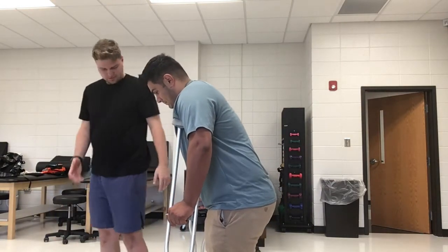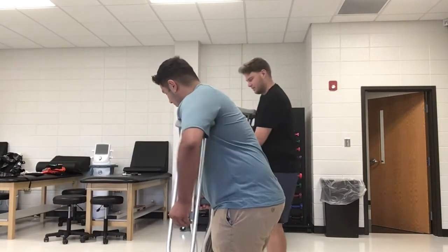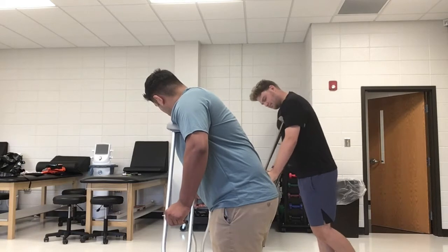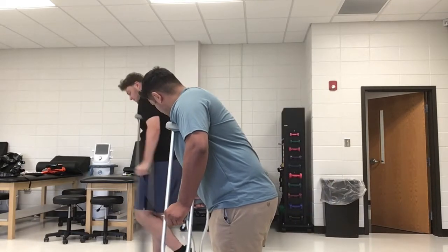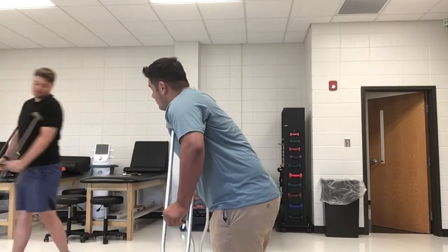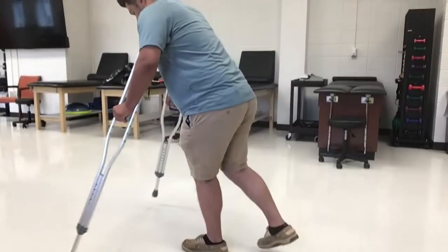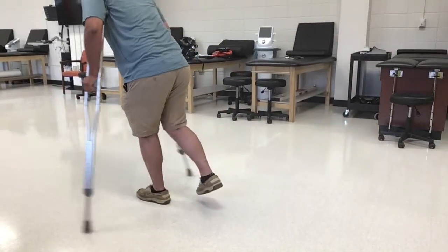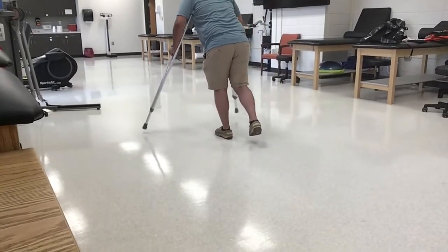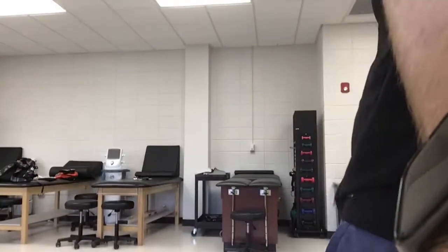So what you'll do is you're going to take your crutches, and you will swing them forward, and then you are going to swing through the crutches, pressing down on the ground, and basically pole vaulting your way through the crutches. Have you try that out for me? There you go, good job. All right, we'll have you come back.